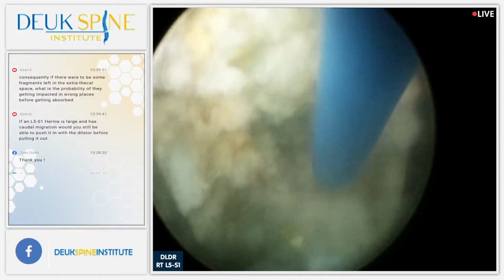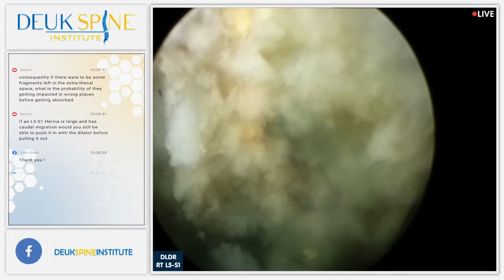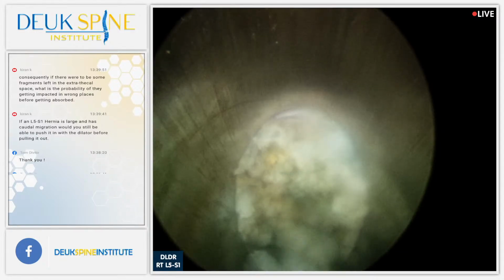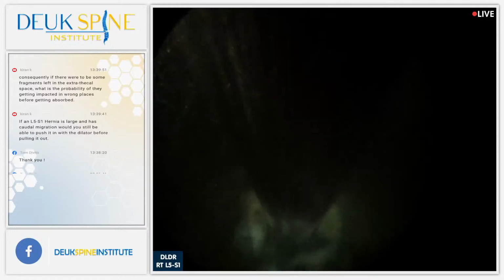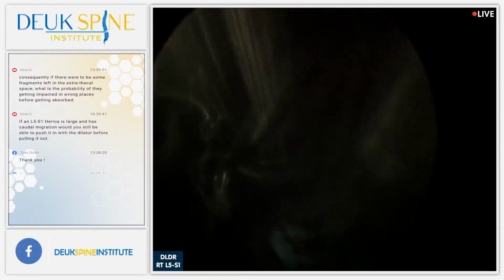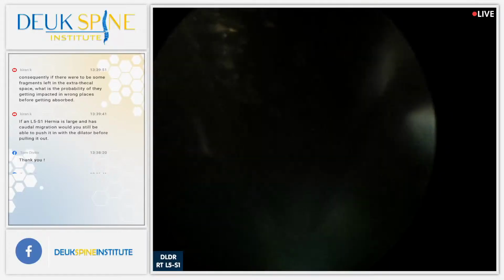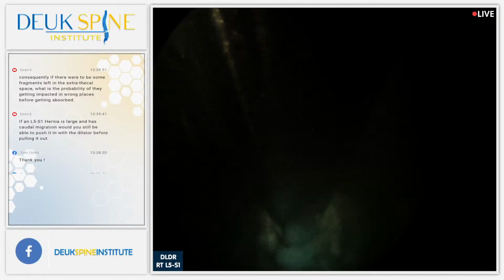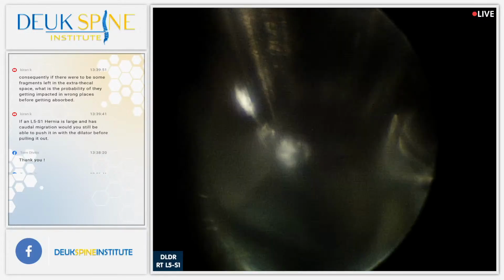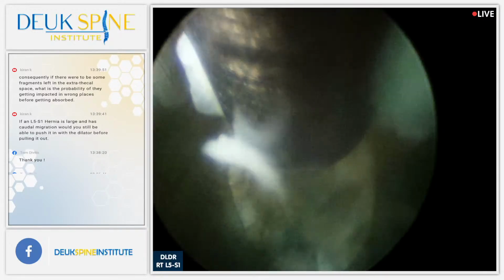So I realized this surgery was the key to fixing back pain at that time. I mean, it wasn't with the first patient, it was after about 5 of them. But the results were so amazing that I was onto it right away, and I realized we had something here. Somehow we were not just fixing leg symptoms, but also back pain. So then I started to think about, what am I doing here? And that's when it dawned on me. We're cleaning out the tear. That's the key. Prior to that, I was fixing back pain with fusion.